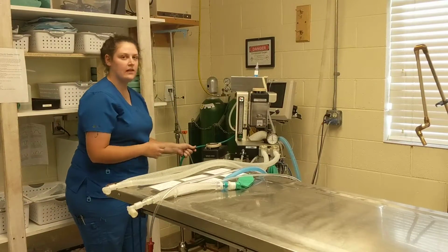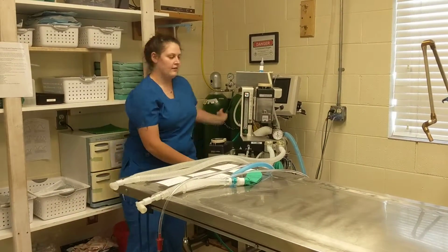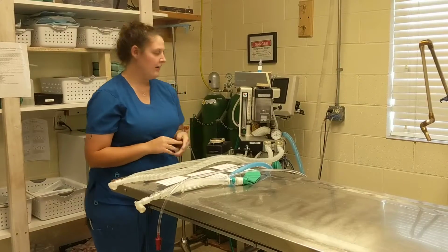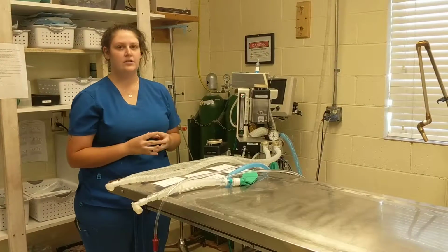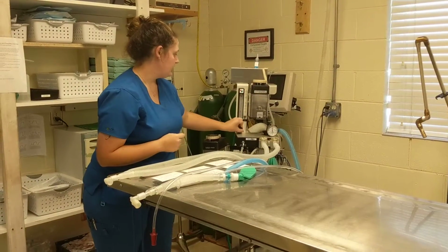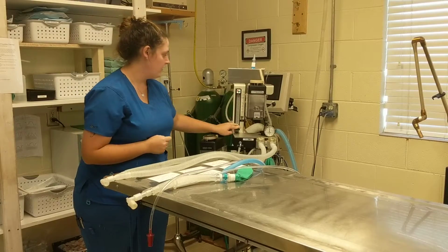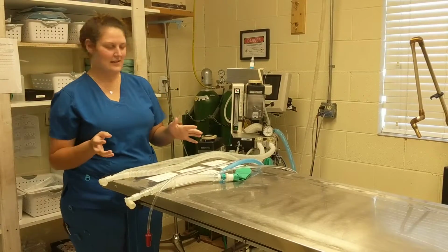Oxygen is hooked up through this line into our machine from our main tank, called an H tank. This tank holds 2,000 psi, and through the flow meter, I'm able to set the correct amount for the patient. You turn this dial up to go higher, and turn it lower to go lower. I'm going to turn this off to save our oxygen so I don't waste any more.